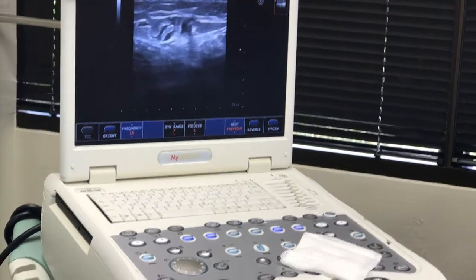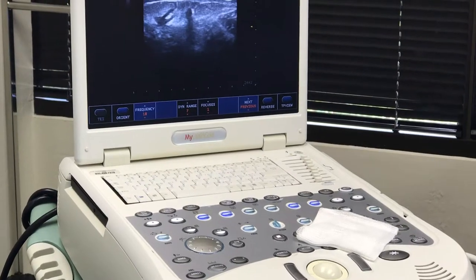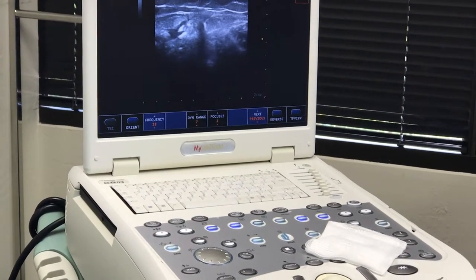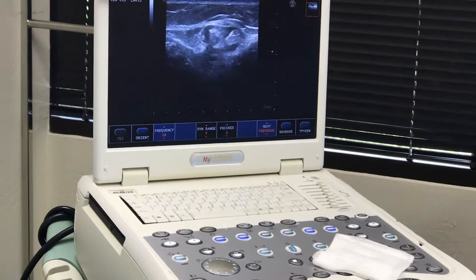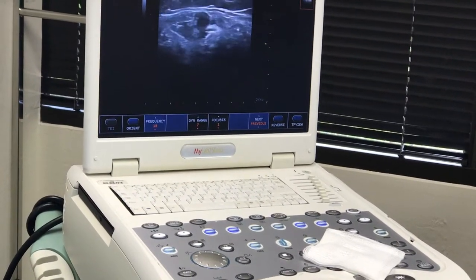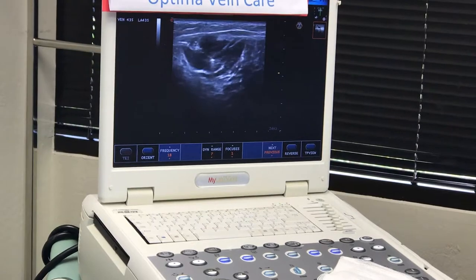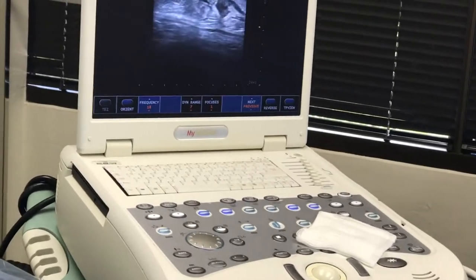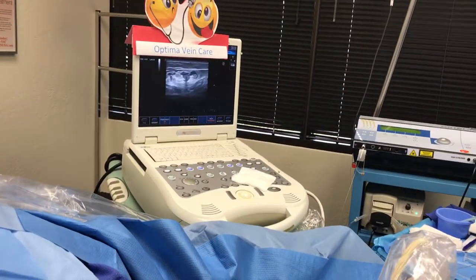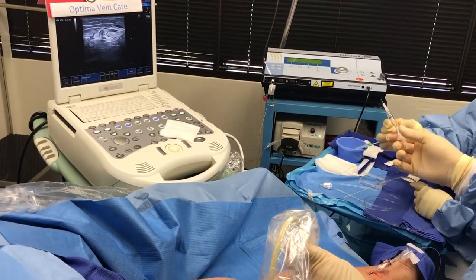You can see that structure on the great saphenous vein as well as on the short saphenous vein. That black stuff you can see on the screen is local anesthetic coming from that bag up there. The bag has got Ringer's lactate in it. We'll have a check and make sure we've got this vein surrounded by a column of black fluid — there's not much fluid right there, so I'll put a bit more anesthesia in.